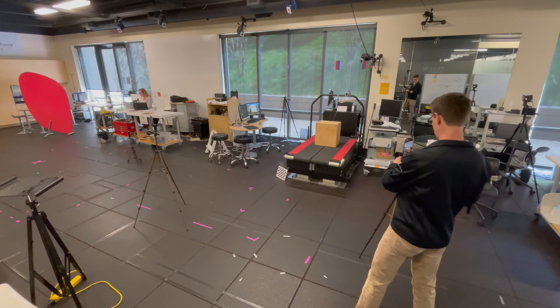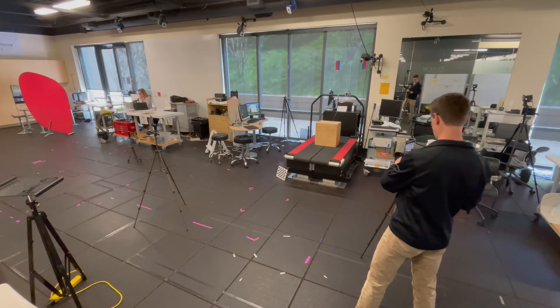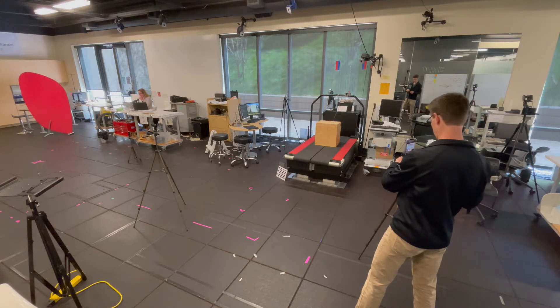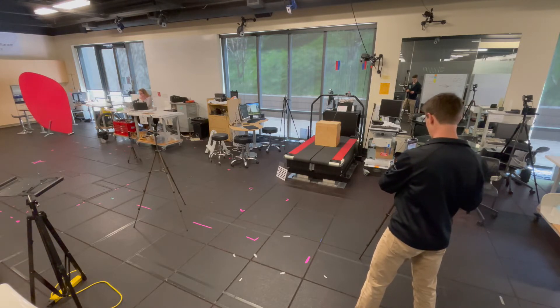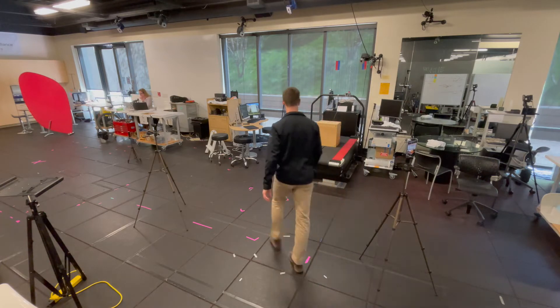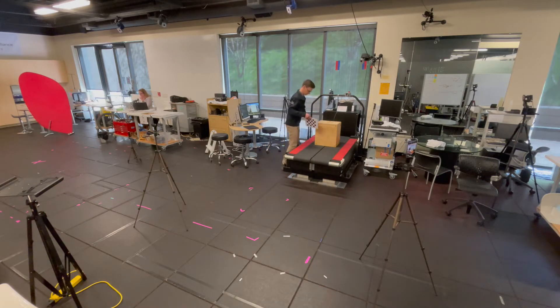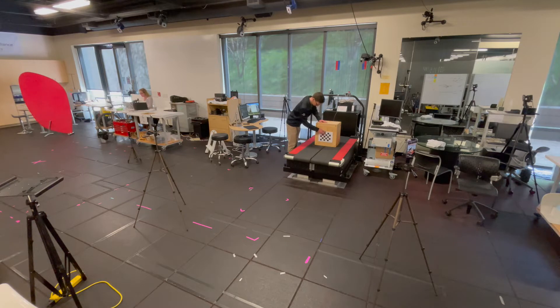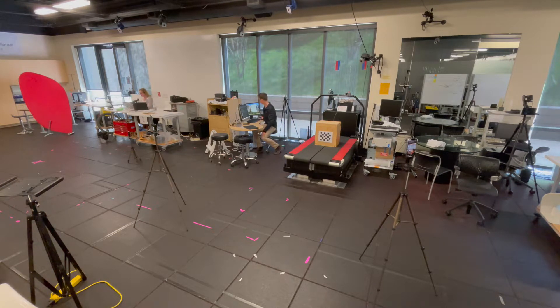Once your cameras are mounted, bring the calibration checkerboard into the field of view. Remember to have it laying on its side and have it as close to the cameras as possible but still in the field of view. It's best for the calibration checkerboard to be right where you expect your participant to be during the data collection.